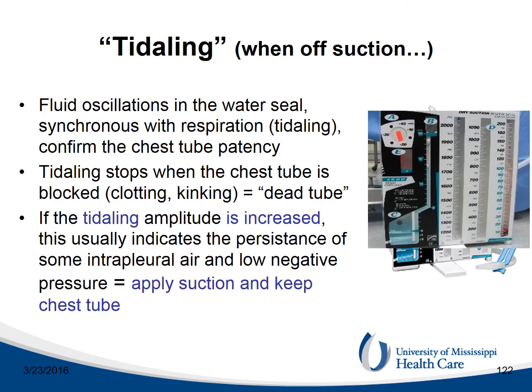When the CDU is off suction, you can study the amount of oscillation of the water in the pleural pressure column, so-called tidaling, which gives information about the chest tube patency, the presence of air in the pleural space, and the respiratory effort. Tidaling stops when the chest tube is blocked, so-called dead tube. If the tidaling amplitude is excessive, this usually indicates the persistence of some intrapleural air and a low negative pressure. In this case, it can be useful to reapply suction and keep the chest tube longer.